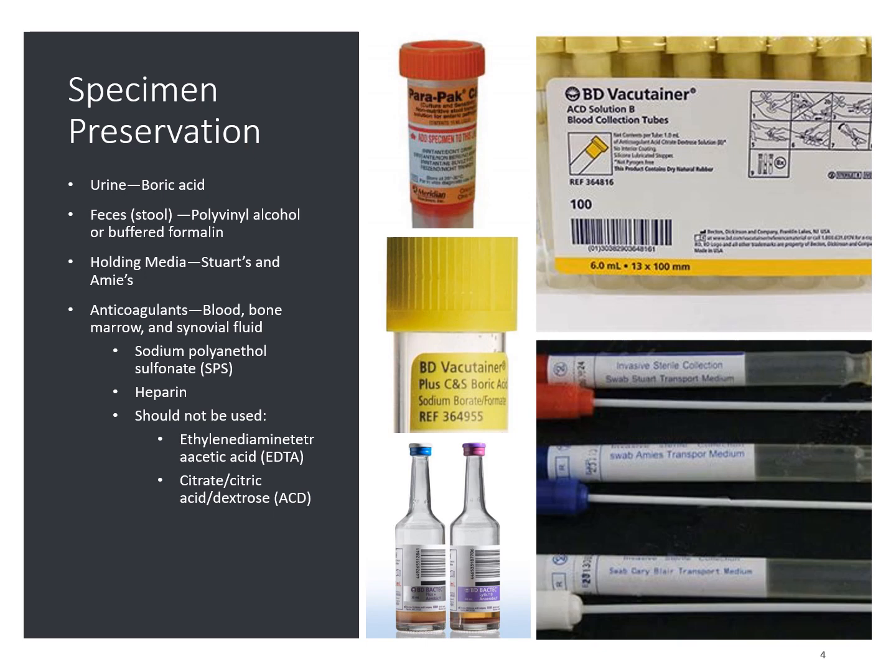You can also have a heparin tube, although it's usually not an actual heparin tube, but a special tube for viral cultures, although you may not see viral cultures much within the lab. However, some of the things that should not be used would be EDTA tubes or ACD. Up in the top right-hand corner, you can see an example of the ACD tube. Something like this should not be confused with those urine collection tubes that are also yellow. These tubes are for HLA typing in blood bank or different types of DNA and genetic studies.